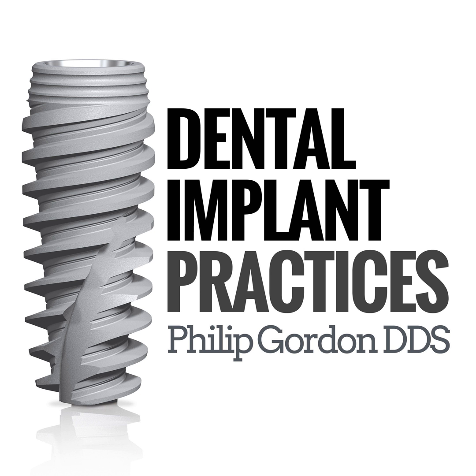I try to develop things, for instance, the healing abutments. I don't know if you've seen the healing abutments of an implant, but I made them like a mushroom so that when you suture, there's a circular lip to hold the tissue down. So it's not like putting a 10-legged cat in a bag, where you're trying to hold the tissue and suture and keep the tissue from coming over the abutment.